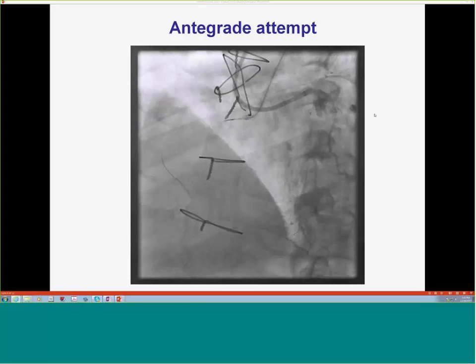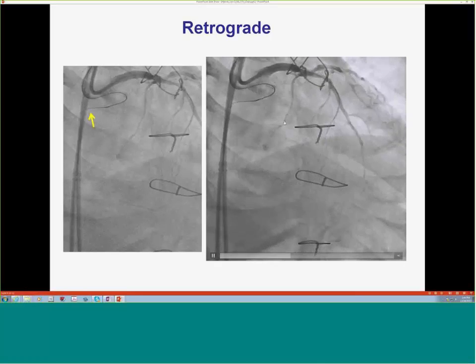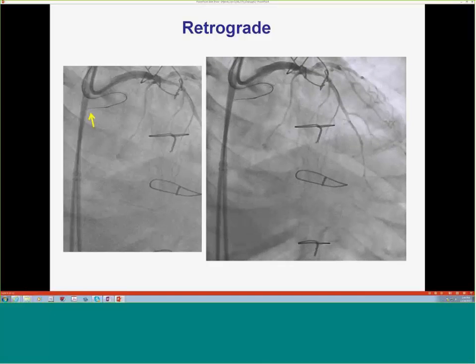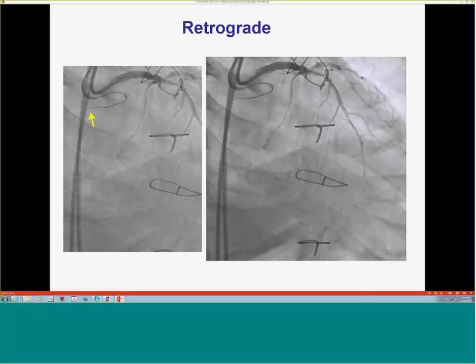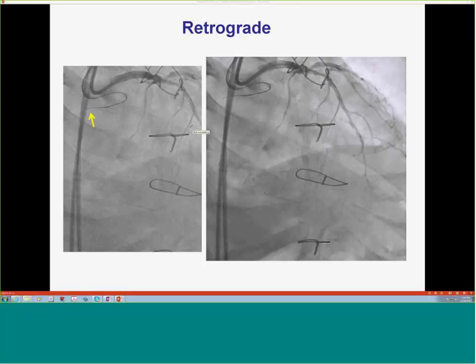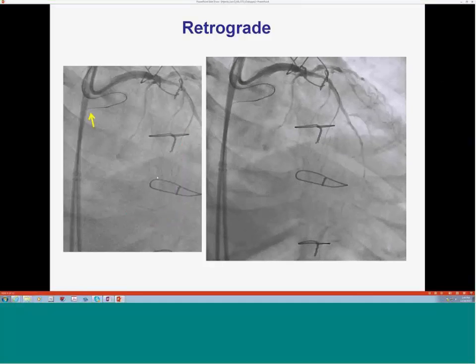So again, the Antegrade wire didn't work, and CrossBoss didn't work either the first time. And this is, again, the same thing as the last case. If one doesn't work, try another option. So we had different collaterals here, and we thought it was going to be fairly easy to get through. And we're trying to get down the collateral now. However, as you can see, it looks fairly decent in this area. But I spent probably an hour and could not get through these collaterals.